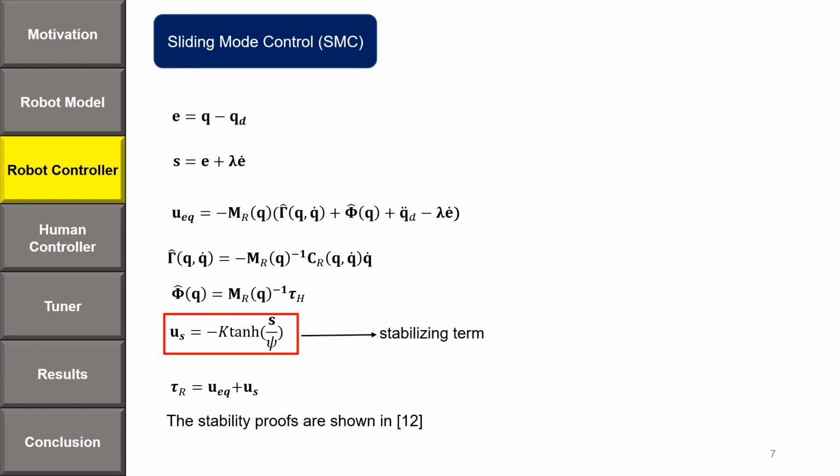Coupled with the high-frequency nature of this term, the discontinuity leads to chattering that causes safety issues and can damage the motors. For this purpose, we replace this term with a smooth continuous tanh function. Note that the final controller has 3 tunable weights.